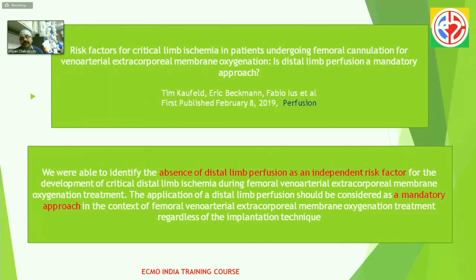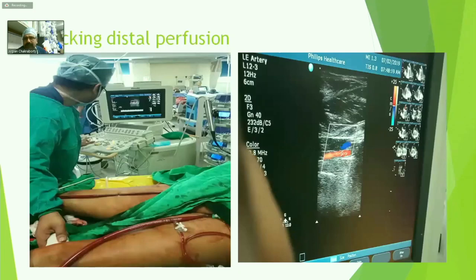And the way we check the distal perfusion, I've shared it many times, even on social media. We check the distal perfusion by changing the knob, changing the three-way with the perfusion, the distal perfusion flow, and we check a flat line of flow which is going through the same limb, which is given by the artery. It is not a pulsatile flow, but you should measure the mean pressure at that point of time, and it stops when you close the flow, and it reopens when you open the three-way.